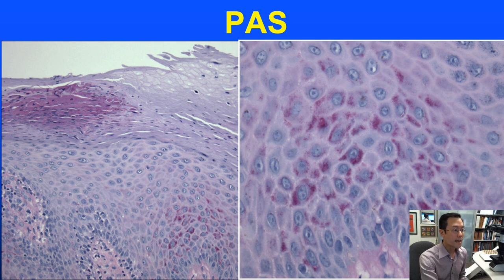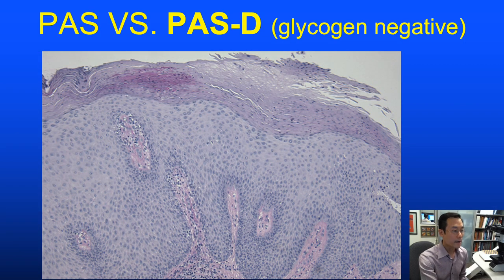Here's our PAS stain—we can see it staining some nonspecific crust in the parakeratosis on the upper left, but more specific is the cytoplasmic positivity shown on the right. On the PASD, the nonspecific crust on the upper left is still there, but the glycogen in the spinous layer is no longer seen.